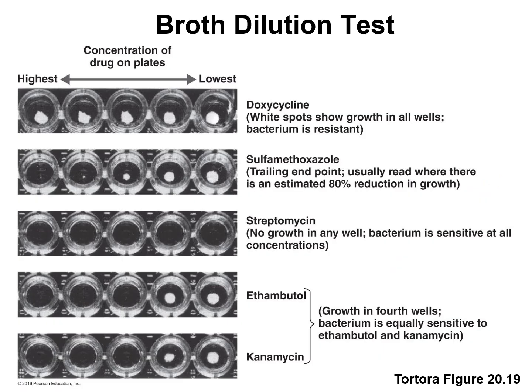A lot of times, instead of using those big tubes, they'll just put the patient's bacteria into these microwells instead. And then they will be able to test lots of different antibiotics in each of these rows going across. We've just got the different concentrations of the antibiotics.